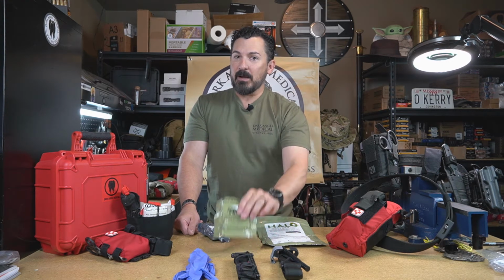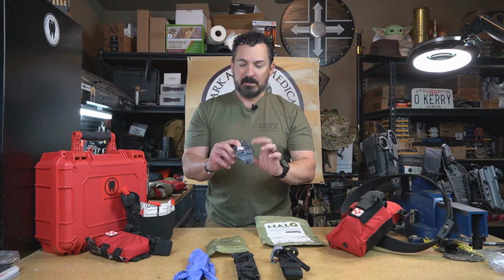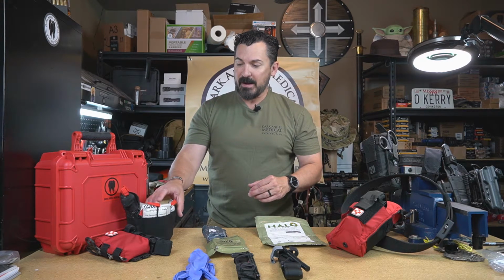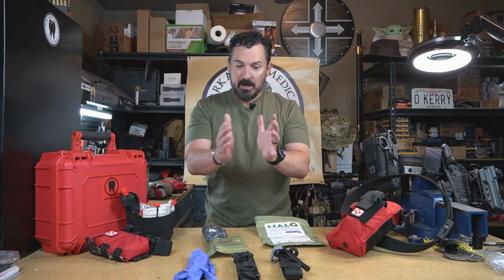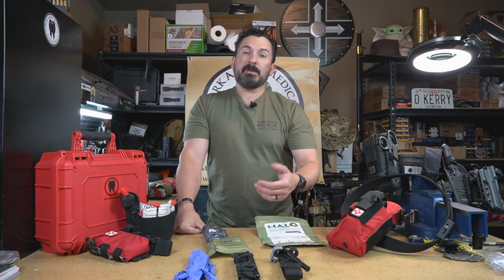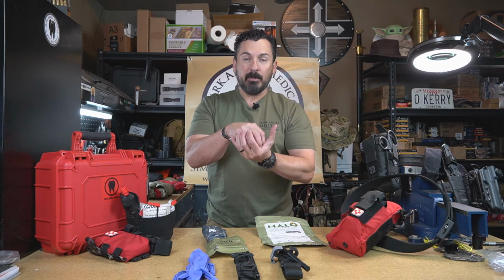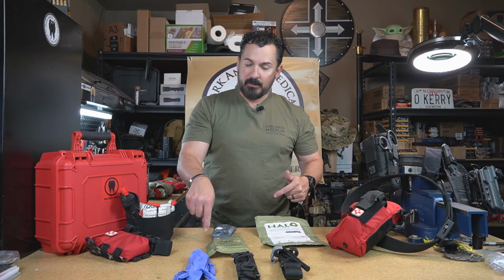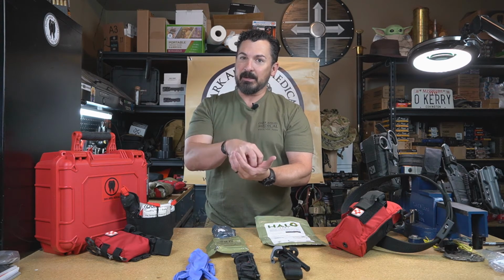And if I've got a hemostatic gauze, a loose hemostatic gauze in a wound, next thing I have to have, number 4, pressure bandage. Okay, this is the emergency bandage. There's a lot of other bandages out there. Like in my ankle kit here, I've got an H&H mini compression bandage. Some of our visor and headrest kits carry the North American Rescue Mini Responder 4-inch ETD, which is a cut down version. Clear Medical actually has a great 4-inch mini compression bandage. So a compression bandage, number 1, if I'm using a hemostatic gauze, I've got to have some sort of reinforcement to hold that compression in there, because we count on 2 things with hemostatic gauze: that's compression and coagulation. And so I've got to have that pressure bandage to focus pressure over that wound, over that gauze that's been packed in there, to maintain that good stable clot.